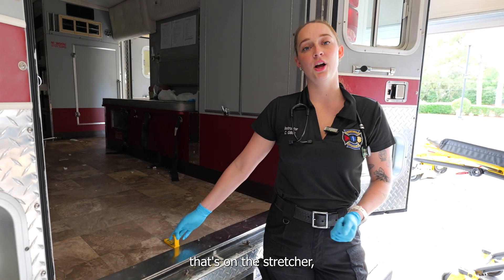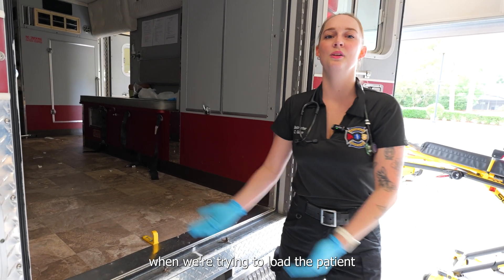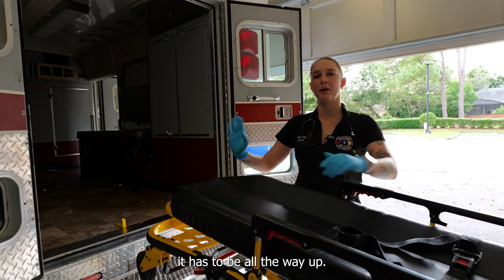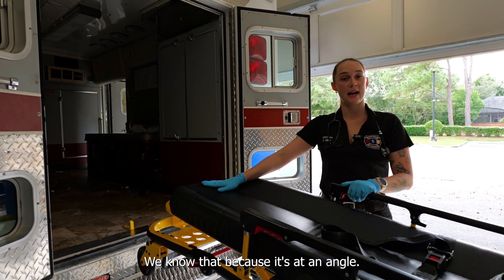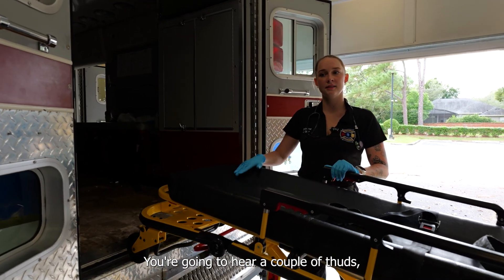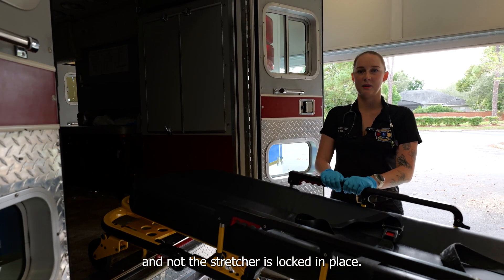The safety bar on the stretcher and this safety hook make sure that the stretcher doesn't fall out of the ambulance when we're trying to load the patient. When we put the stretcher into the ambulance it has to be all the way up, otherwise it's not going to fit. Our stretcher is all the way up — we know that because it's at an angle and the sawtooth on the bottom confirms we're all the way at the top. You're going to hear a couple of thuds and then you're going to bring the stretcher back and make sure that the safety is on and that the stretcher is locked in place.